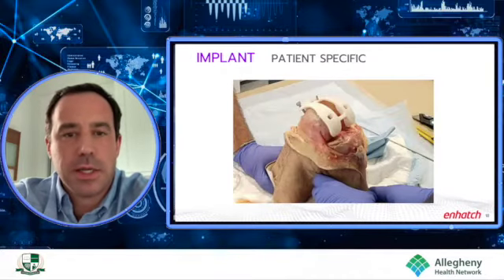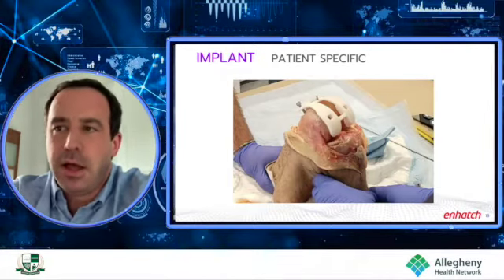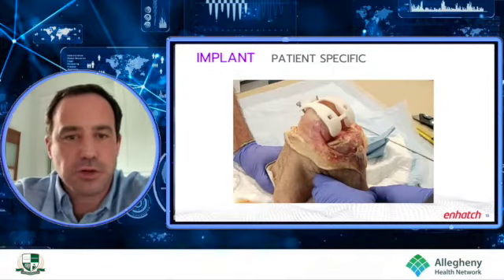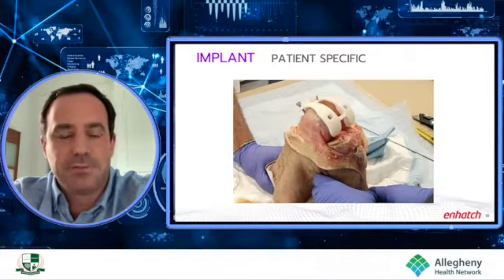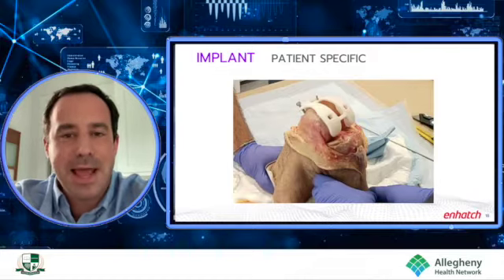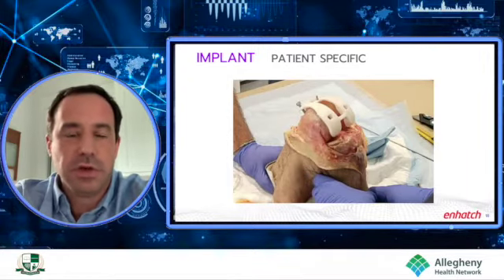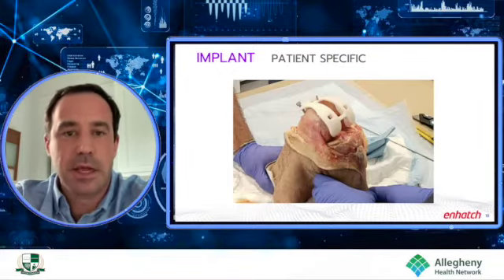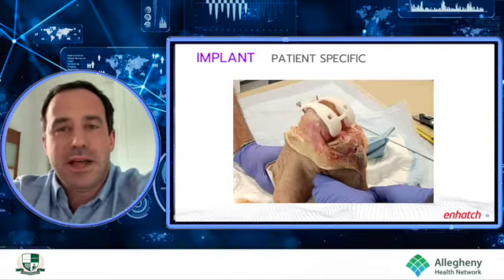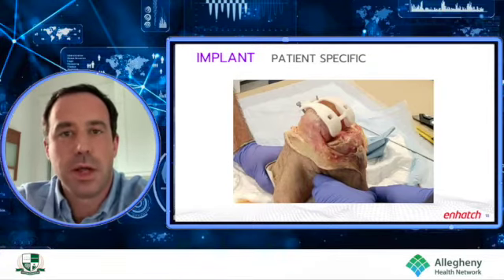Patient-specific guides for implant surgery. In this picture, you see a PSI guide on a cadaver for a knee replacement. AI is already being applied to this in a very interesting way. So at present, patient-specific guides for knee replacement almost exclusively are CT-based. There are one or two systems that are MRI-based. AI allows this, or will allow this, to be done with two-dimensional imaging, where the algorithm essentially learns from seeing enough x-rays and enough anatomy that it can base what it's doing on its learned knowledge and apply that to what it's seeing, and take a two-dimensional image and convert it into a three-dimensional model that then becomes the basis for the patient-specific guides.